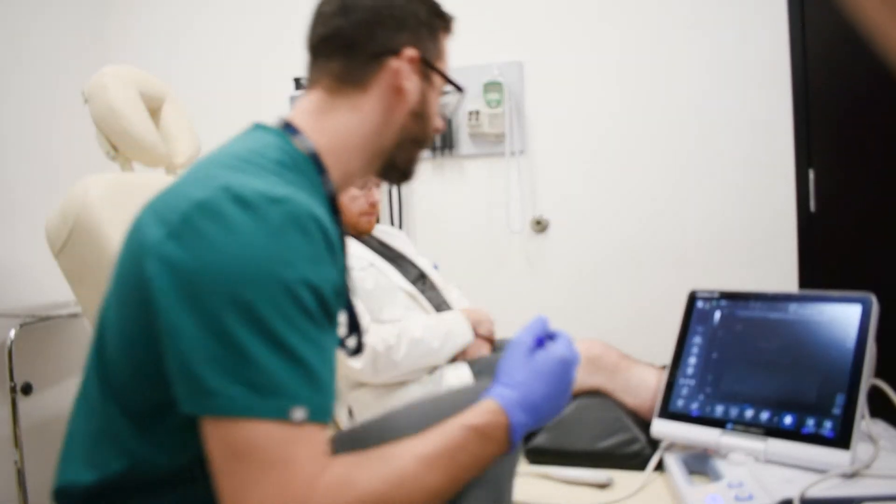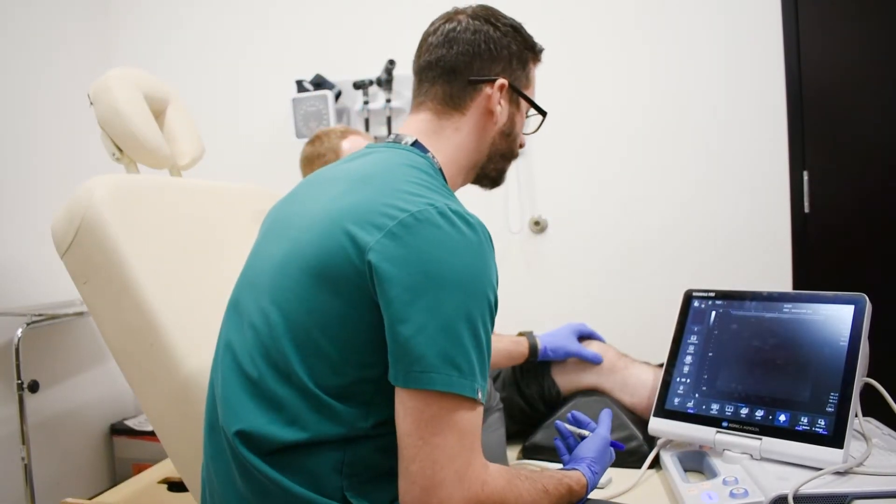Our main landmarks for the knee — obviously we're going to have our kneecap.